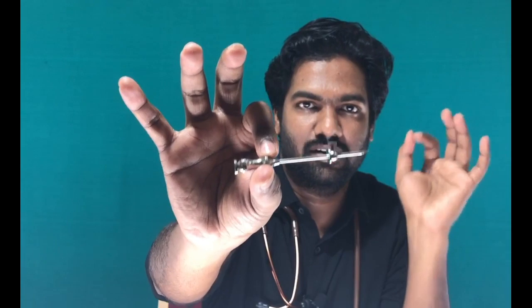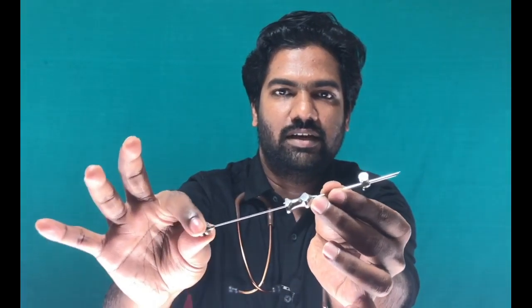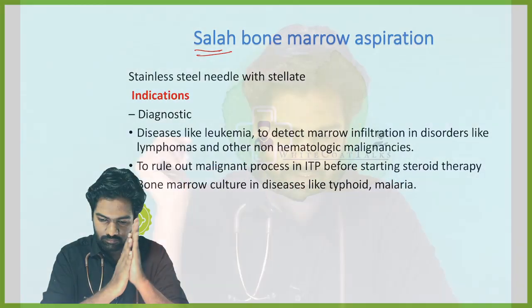Now, identification first. Is it visible, guys? This is Salah's bone marrow aspiration needle. This is the stylet inside, and this entire thing is the needle. It's like a trocar and cannula outside, and inside it is the stylet. Now there is this extra thing which they have given here, called the guard. This guard will not be present in a bone marrow biopsy needle. Note it down. The presence of the guard tells you that it is a bone marrow aspiration needle. Any difficulty in this?